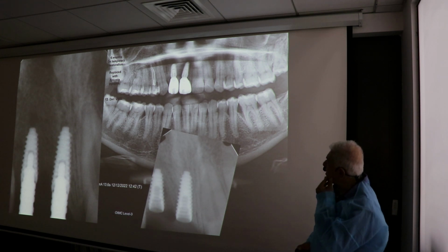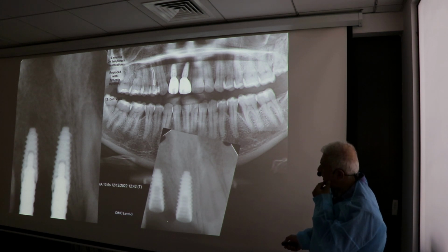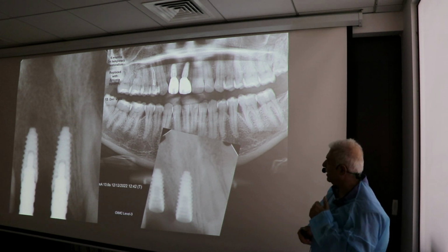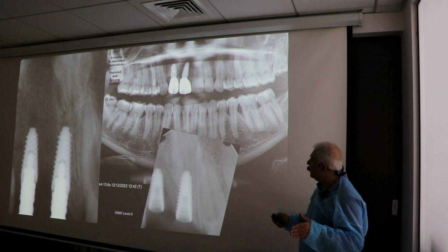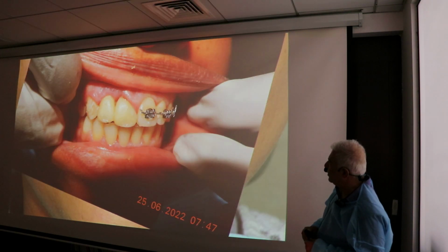Okay, that's not my worst nightmare. My worst nightmare is loss of bone in the inter-implant area. I thought the bone would stay because I left the 3 millimeters, but it didn't stay. So now I think we should do something to solve that problem.